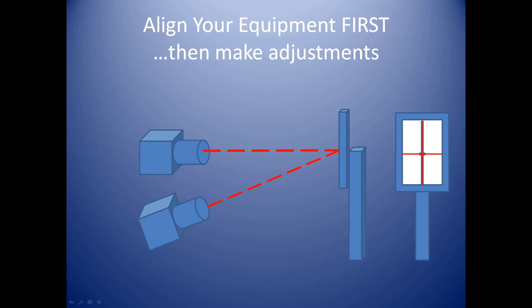You can do this examination on the table if need be, but it is significantly easier to do it at the upright bucky. When centering the camera with the upright bucky, make sure your crosshairs are centered on the bucky itself — centered horizontally and vertically — and have your film loaded up. You're going to need 14 by 17 film, which is the same size as a regular chest x-ray cassette loaded into your bucky if you use cassettes.